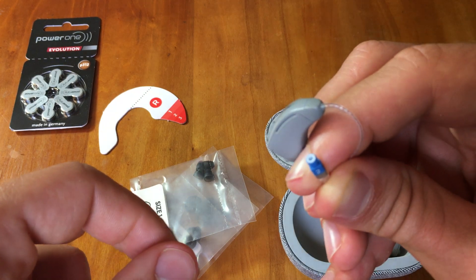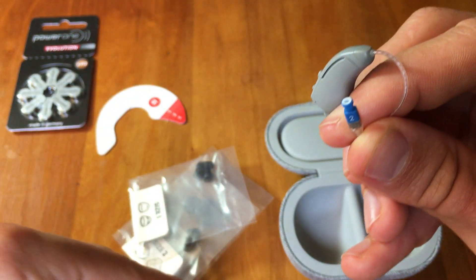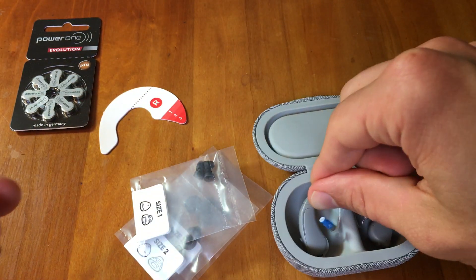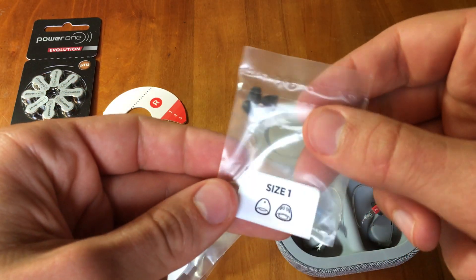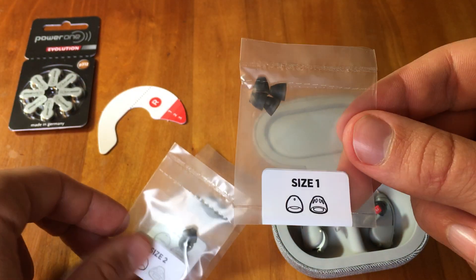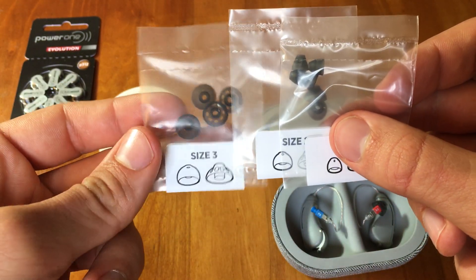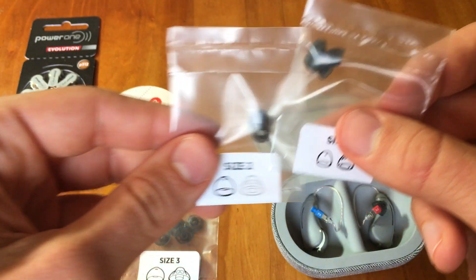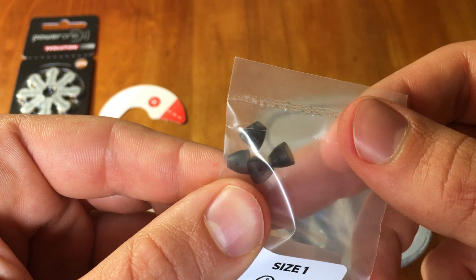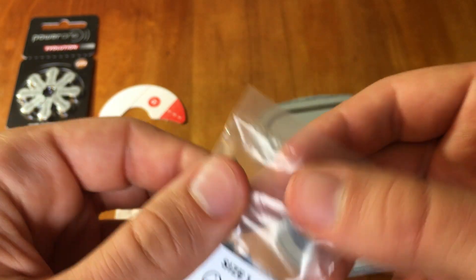I did not see any white filters included in the case, which is somewhat surprising. Taking that off and putting it back in, you can see they also provide different sizes of tips. We have size 1, size 2, and size 3. Each of these packages comes with one size that is considered an open dome and then a closed dome.